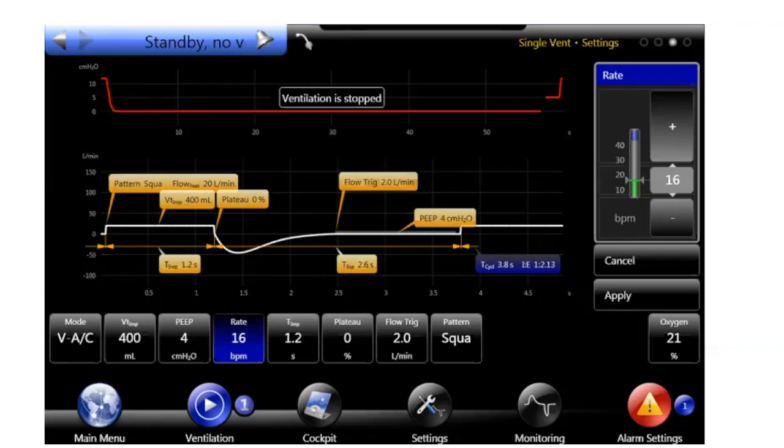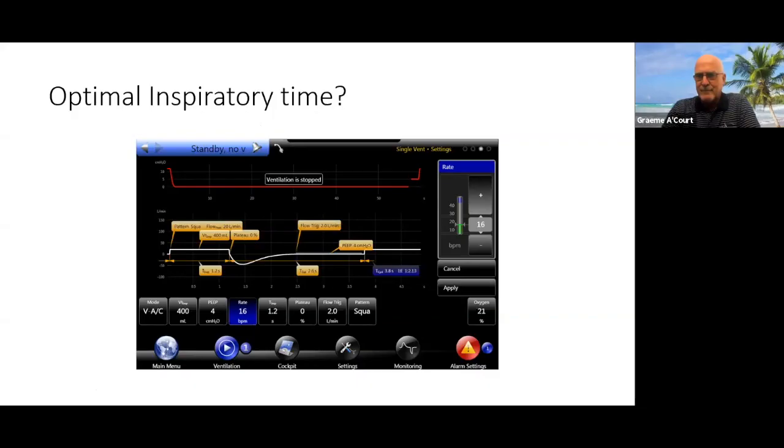David or Matt, what do you think? My job is to ask the questions, presenter. Steve, this is reversed to you as well. Are you asking for any given patient, what's the ideal I time? That's right. What do we consider? Do we think about the I time? Actually, Matt, you triggered this off when you mentioned 0.8 of a second, so I thought I'd go back to this again and talk about timing.